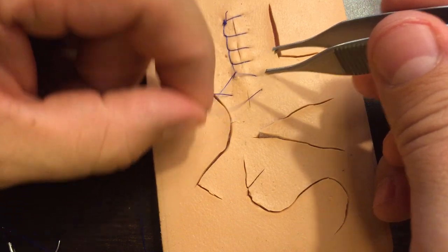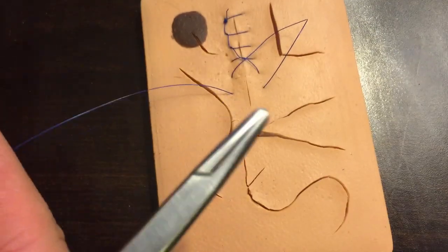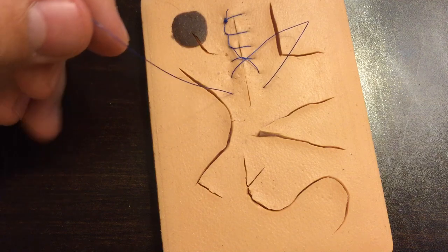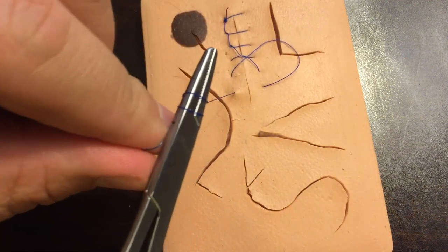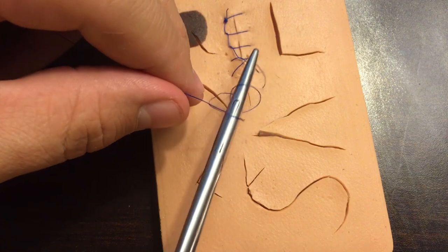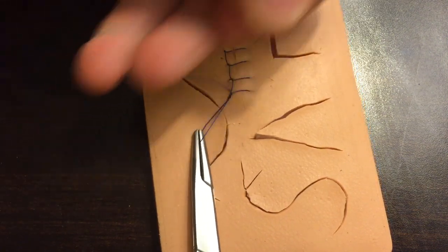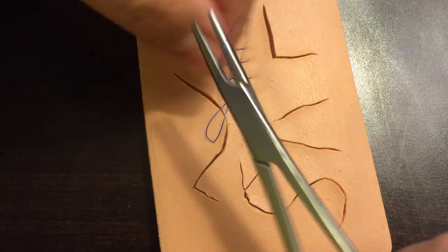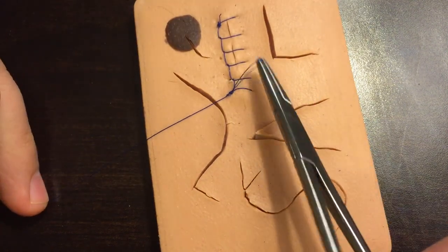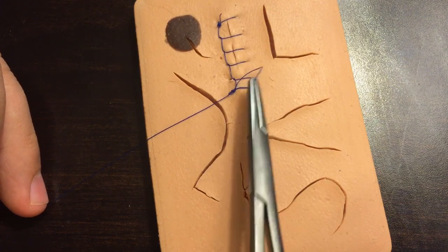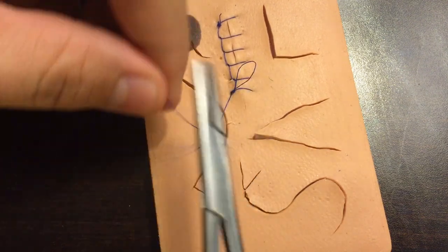Now we need to finish this off. So you want to leave this loop open like this and we're going to instrument tie it against that loop. So we're going to instrument tie like this, a double and pull this loop a little bit tighter. I'm going to grab inside that loop. I'm going to pull it like this. So my knot is going to be down here in the bottom like this.